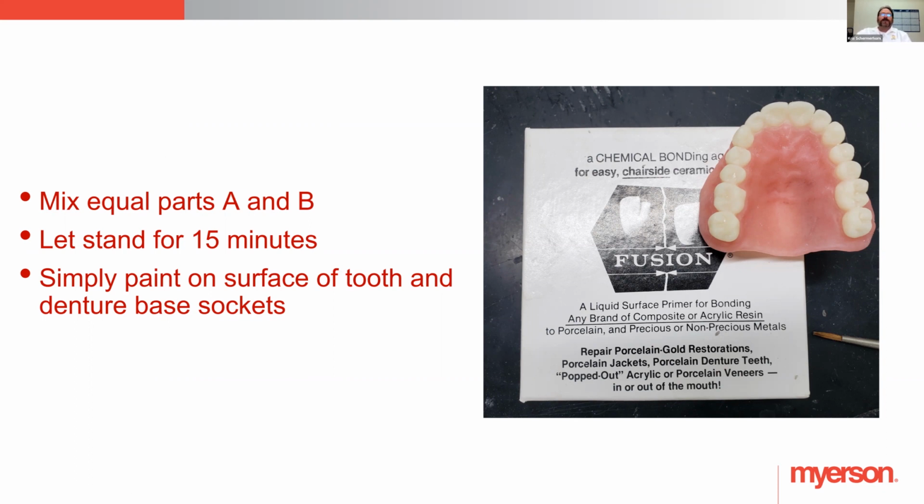So in this instance, you will process by milling a denture base, or you will process by printing a denture base, whatever that might be. If you're printing a denture base, we find that Trusana is pretty accepting of bonding to a lot of different materials. So I would recommend that you follow the manufacturer of whatever you printed your denture base out of. Follow the manufacturer's recommendations on bonding. If you have some questions for us on a specific company, you can give us a call. We can give our experience if we have it. But acrylics bond to Trusana really nicely, so it's very accepting to that. So I have good confidence that you won't have many issues dealing with a composite bonder when you deal with primers or anything like that. But that is not a guarantee. It's just been my experience.